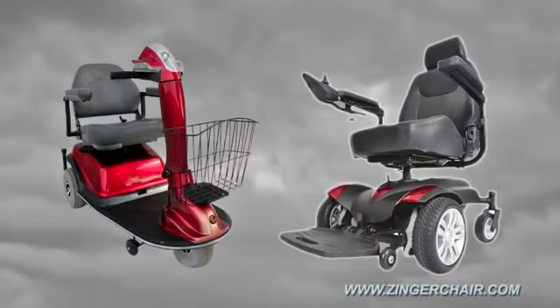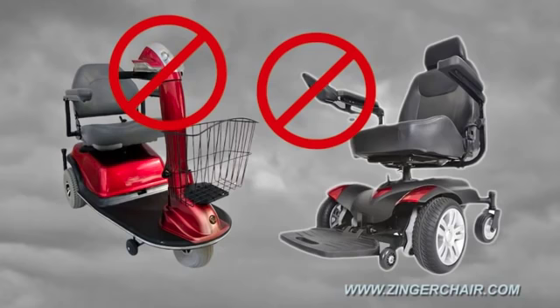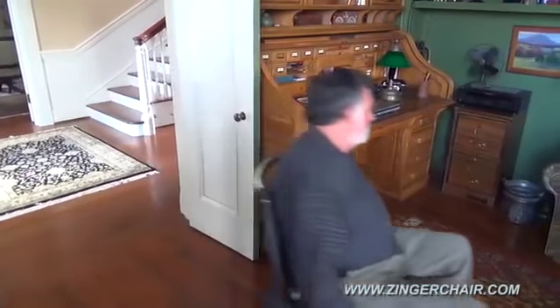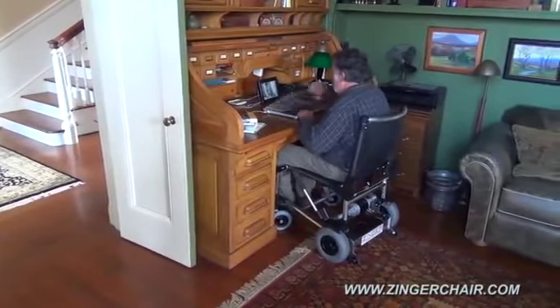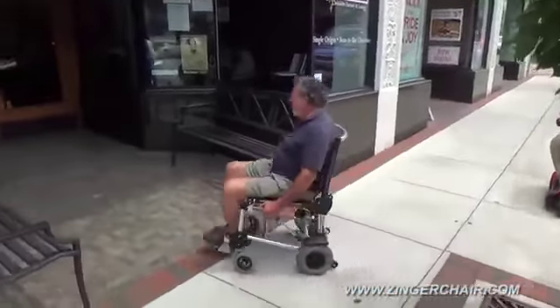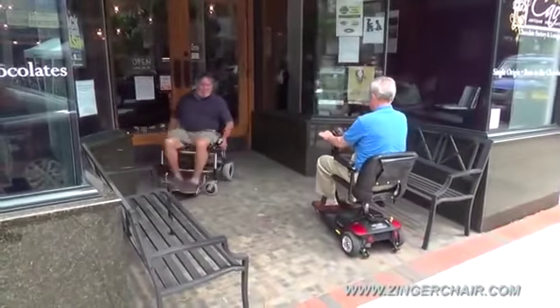Virtually all other mobility devices steer with either handlebars or a joystick. The Zinger's revolutionary patented two-lever control system steers with levers at your sides. There's nothing out in front of you. This makes the Zinger the only mobility device that you can pull right up to a table or a desk. Combine that convenience with turn-on-a-dime maneuverability and the Zinger is the ideal choice for in the house as well as out. Its quick and nimble handling makes it actually fun to drive.